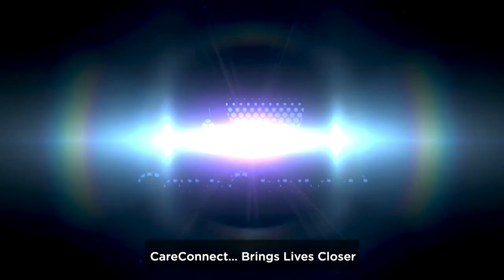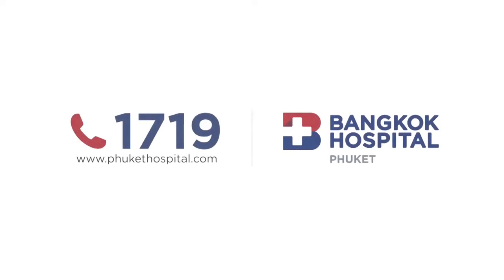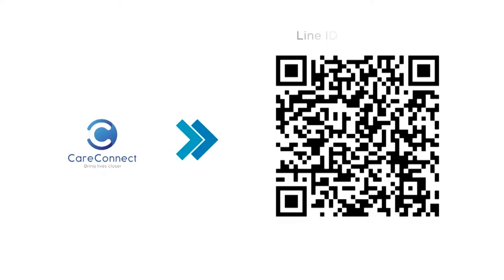CareConnect brings lives closer. Bluetooth measure completed.